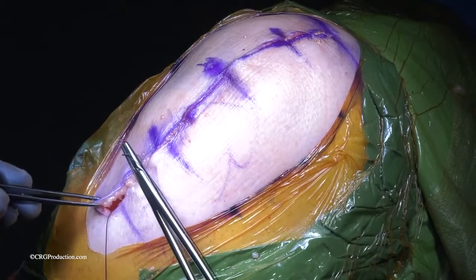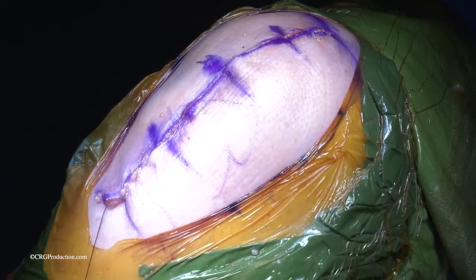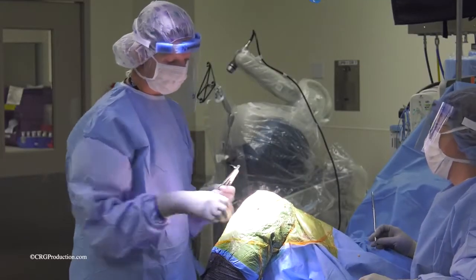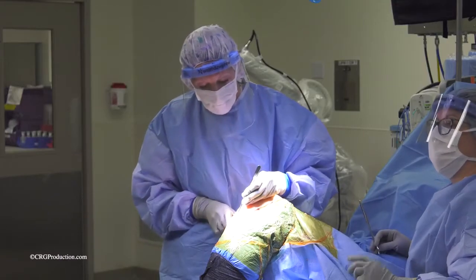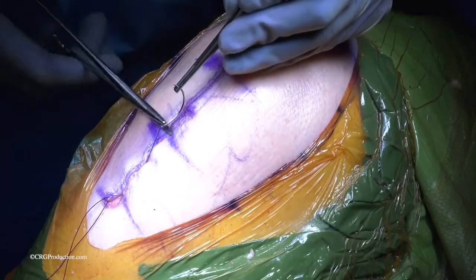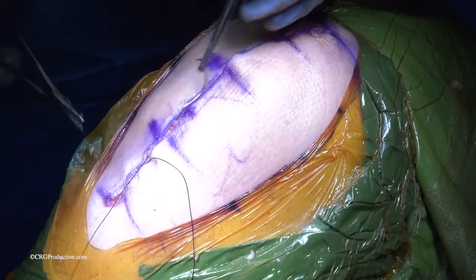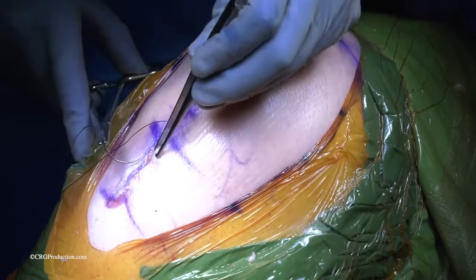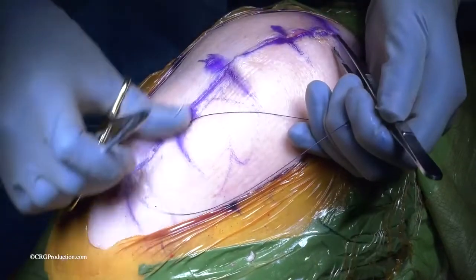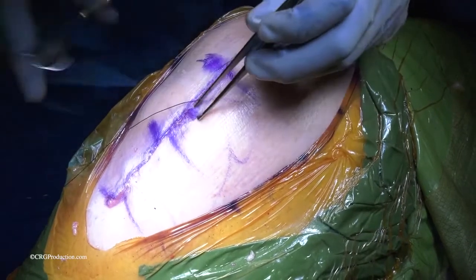At 3 weeks, they return to the orthopedic office for reevaluation. The knee is inspected for satisfactory healing. Calf tenderness is evaluated to ensure no leg clot. Range of motion is tested of the knee joint itself to ensure that the patient is doing their exercises. And lastly, an x-ray is taken to ensure appropriate position of the knee joint. We've been quite fortunate to note that the Mako robotic surgery works very well and is reliable in giving us a perfect alignment of the knee replacement in all cases.